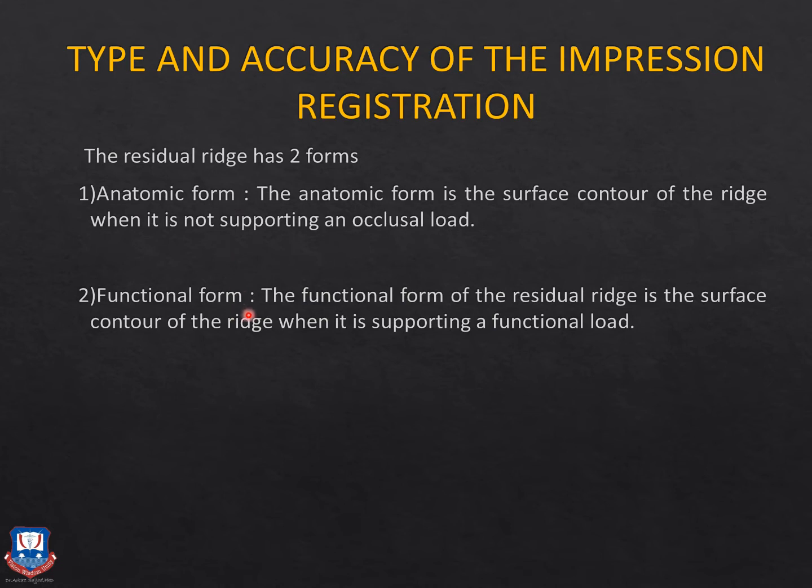The second is the functional form of the residual ridges, when the distal extension bases, especially the posterior residual ridges, are under functional loading or occlusal loading.